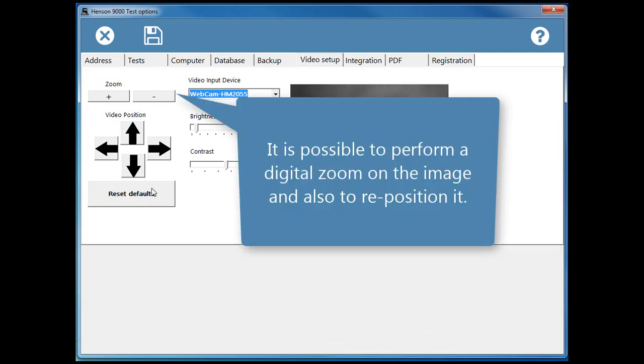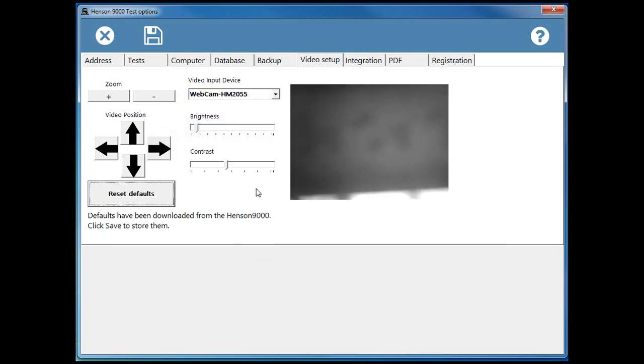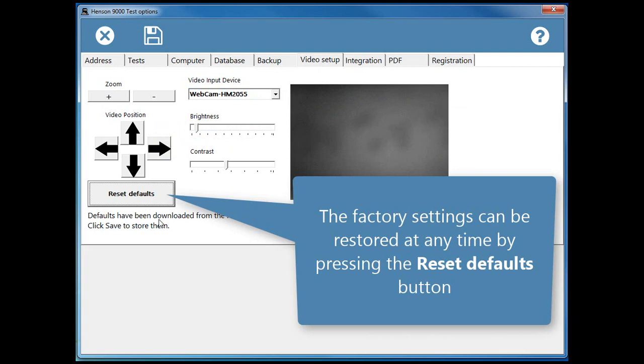It is possible to perform a digital zoom on the image and also to reposition it. The factory setting can be restored at any time by pressing the reset defaults button.